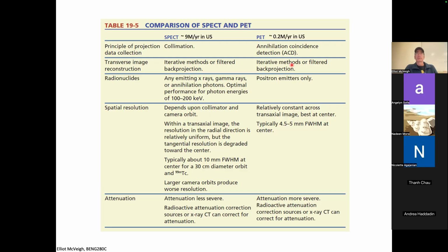They've been at it for 5 or 6 years full time, and everybody's come out with their own deep learning reconstruction. Some of them say it's deep learning reconstruction, but all it really is is they do a standard convolution back projection algorithm and then denoise with deep learning, which is an approach, right? So you just say, look, if I make that picture and then denoise to the solution I would get with the inverse thing, then why don't we just learn how to do that? And so that's what a number of them do, really. They do an underlying standard recon plus a denoising step with their deep learning thing.